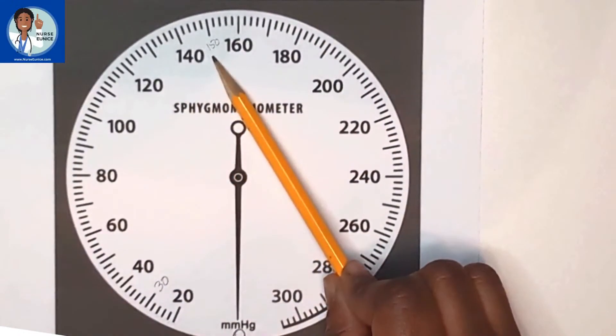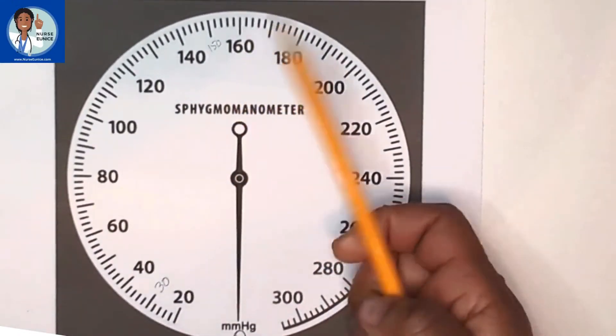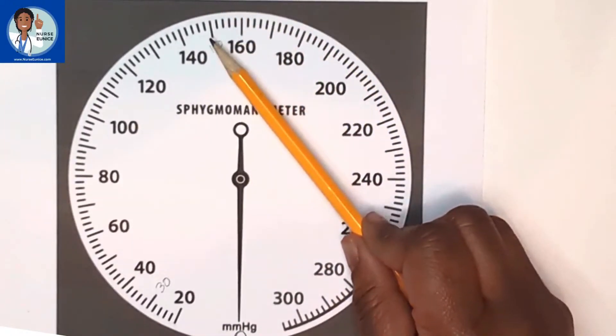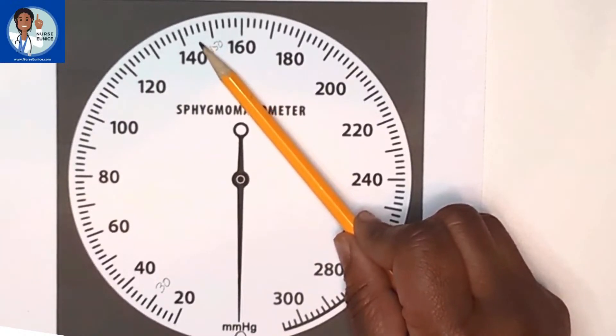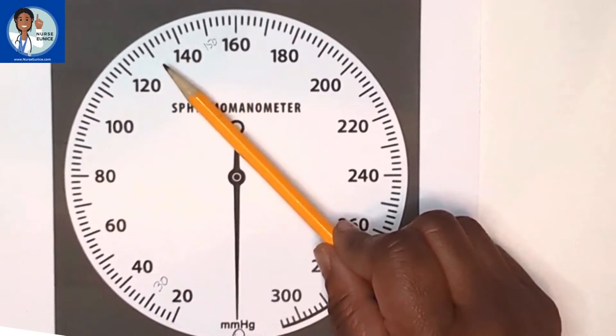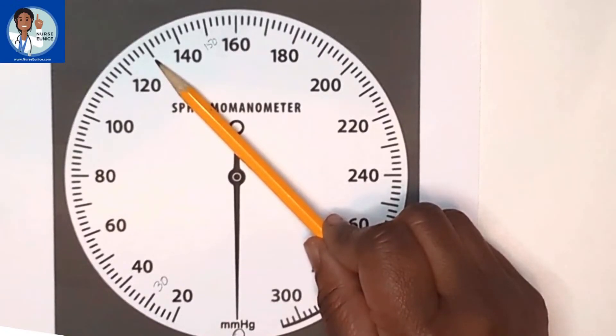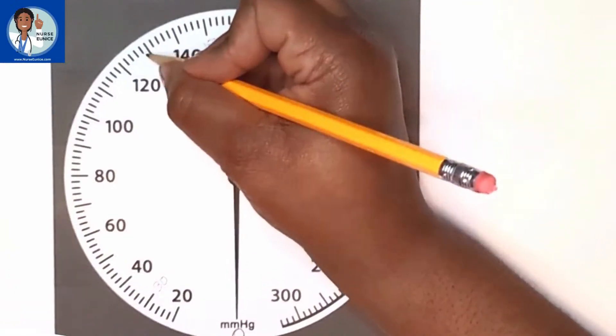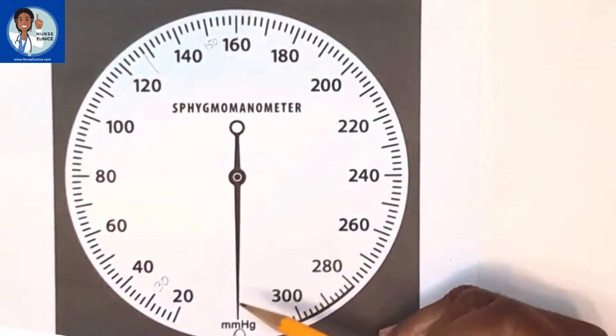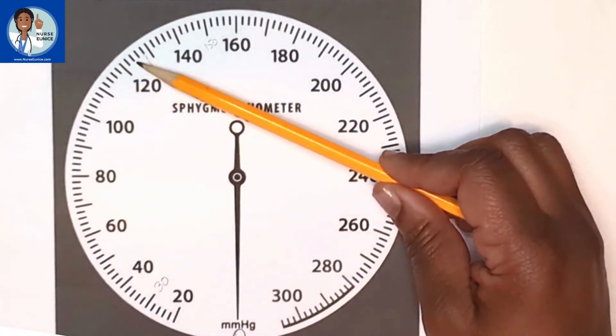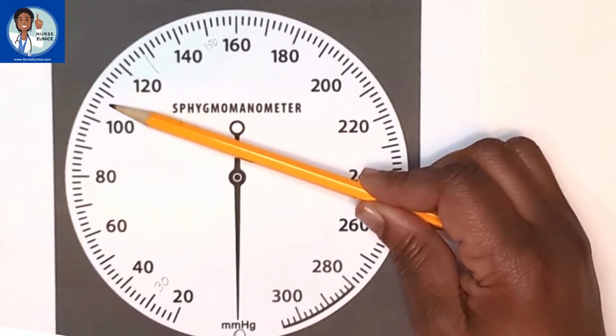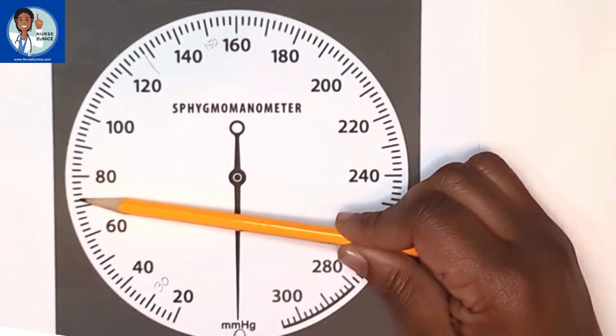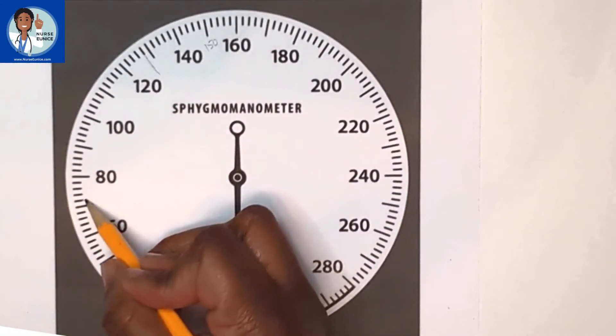We're going to pump the cuff up to 150, and then we're going to gradually release the air valve. We're going to turn it counterclockwise, turn it back towards us. The needle should drop about two millimeters of mercury per second. Where you hear the first thump is going to be called the systolic pressure. You're going to continue to release the air slowly. Wherever you hear the last thump, and it gets really light, that would be our diastolic pressure.